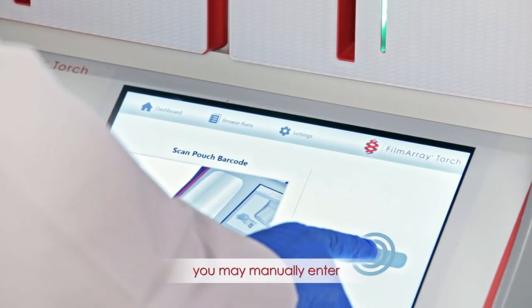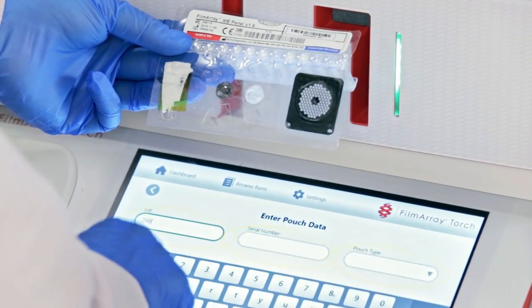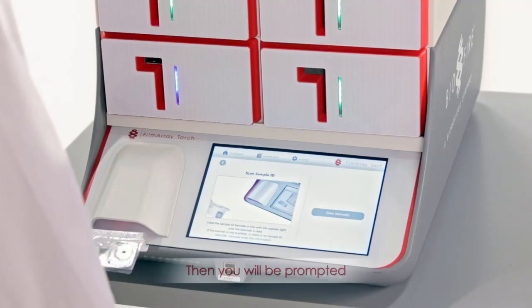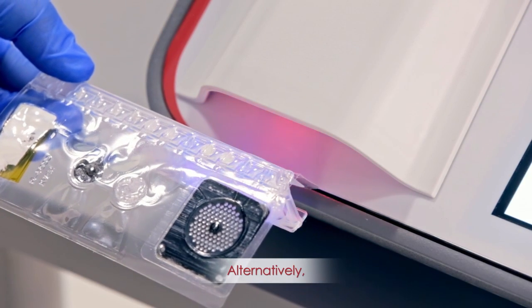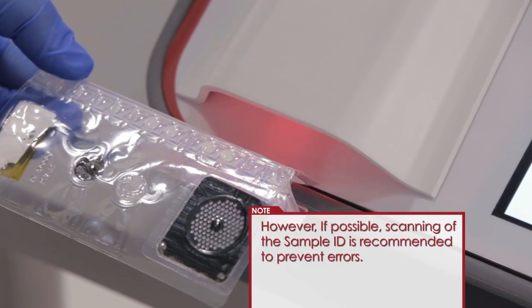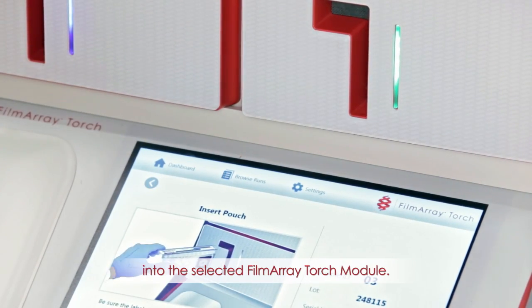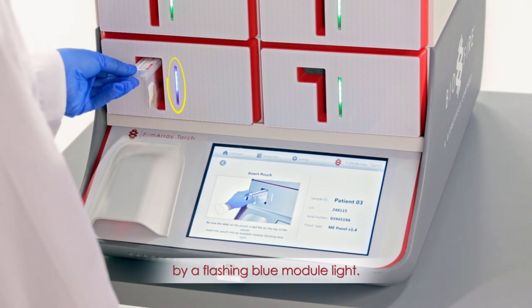Alternatively, you may manually enter the lot number, serial number, and pouch type. Then, you will be prompted to scan the sample ID with the barcode scanner. Alternatively, you may enter the information manually. However, if possible, scanning of the sample ID is recommended to prevent errors. Insert the pouch into the selected FilmArray Torch module. The selected FilmArray Torch module will be indicated by a flashing blue module light.